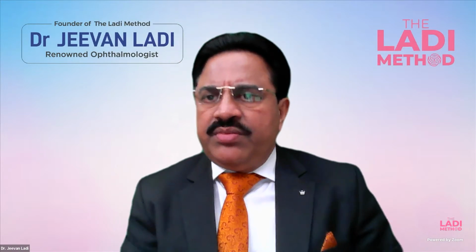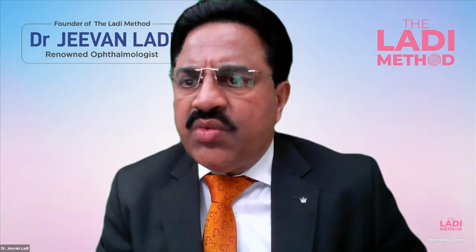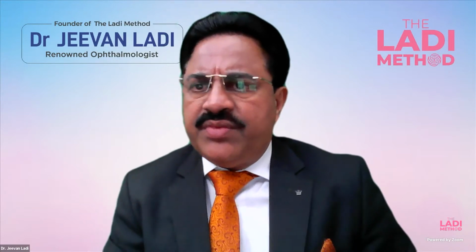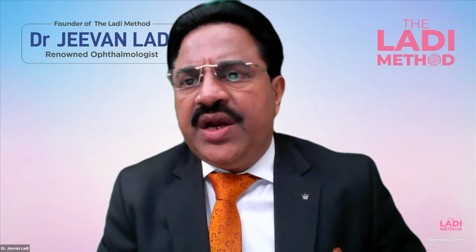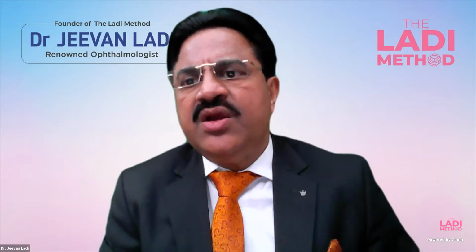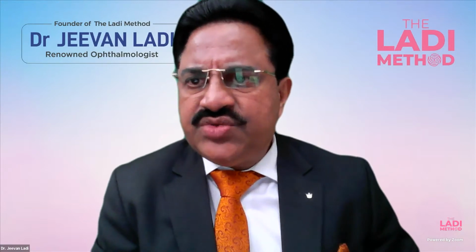There's a question from Dr. Kaushik Shah from Maharashtra. Why was the anterior chamber depth of the immersion scan not considered, and why was it taken from Cirrus? You have an option of taking it from the immersion also. Since we were taking optical biometry anterior chamber depth from IOLMaster, we wanted another method which is taking an optical measurement where the acquisition levels are considered to be very good. So that's the reason we took it.